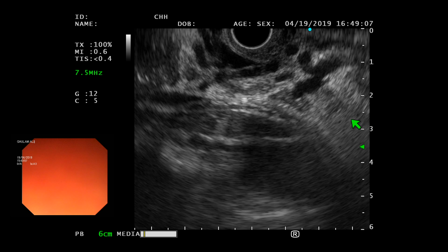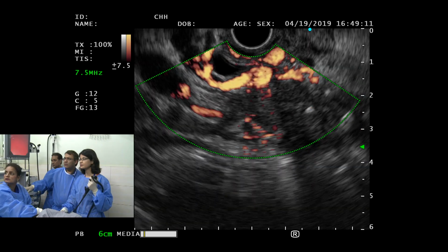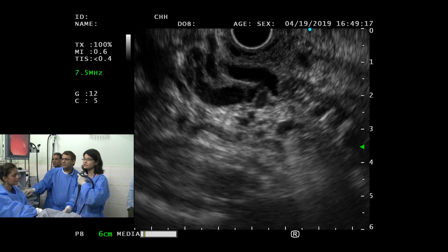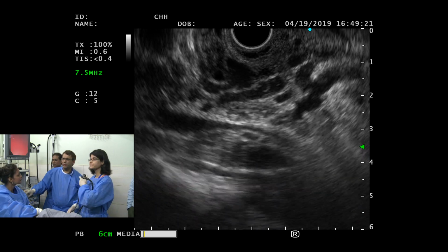You got the cross-sectional view of the duct. तो आ रही है duct. Beautiful view. Yeah, लेकिन इसको ट्रेस नहीं हो रहा इस तरफ. So you trace. So much distortion there.